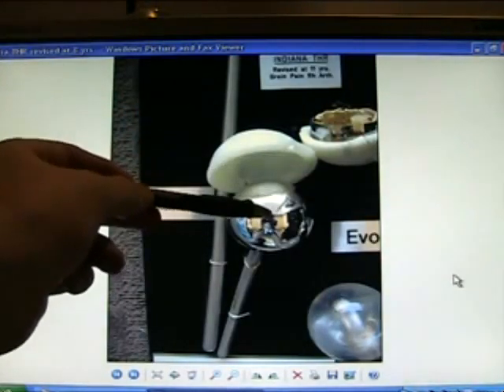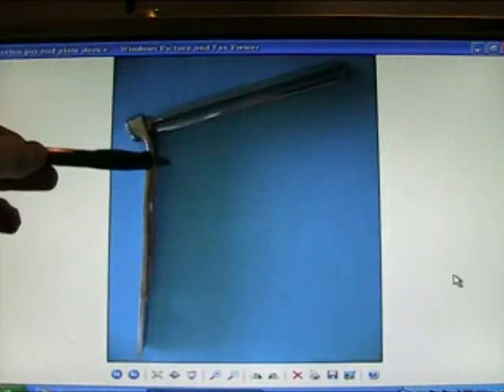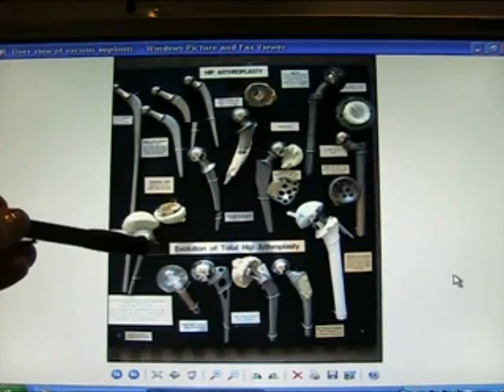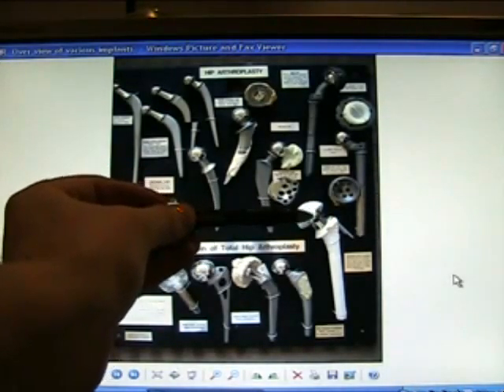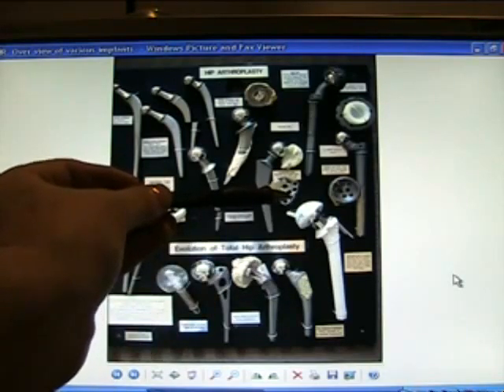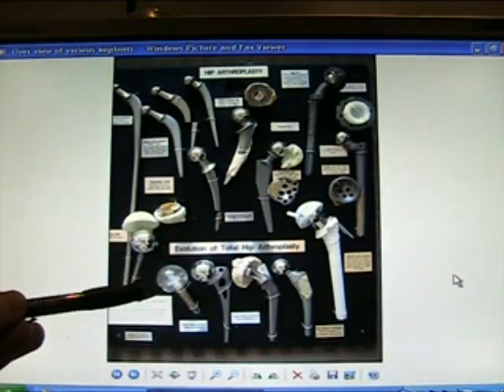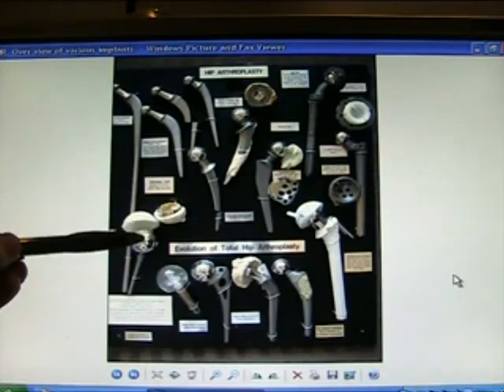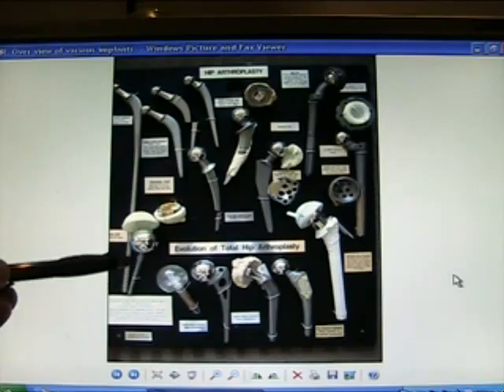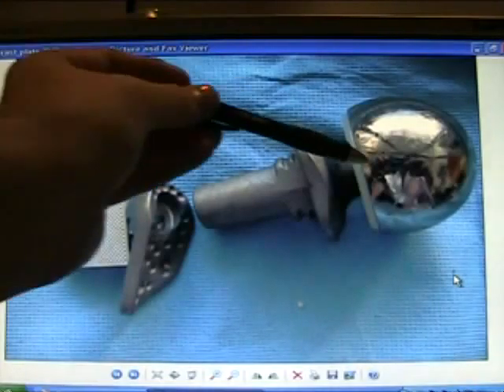This is a TARA total hip replacement, cyclic resurfacing type with a slim stem, revised after eight years. A Thornton pin and plate. Here's the whole story of hip arthroplasty in one picture — the evolution. The isoelastic — a plastic one — they loosened up prematurely. Various cages that we use to fix defects on the acetabulum. Also here is a resurfacing type configuration with a narrow slim stem, similar to what is used today.